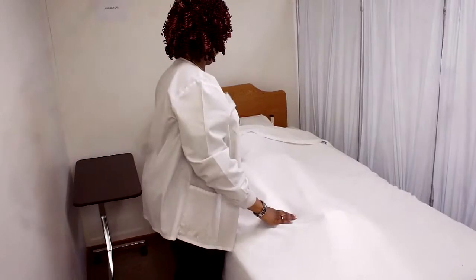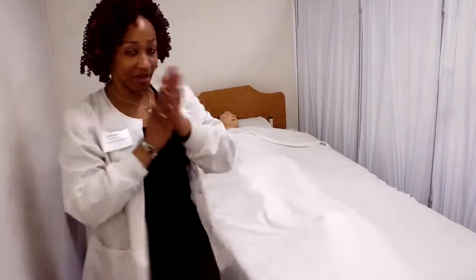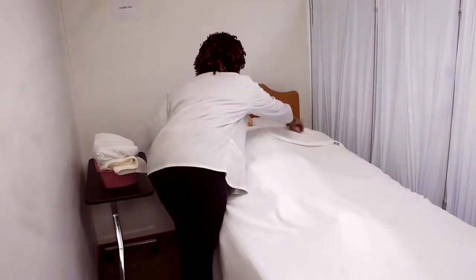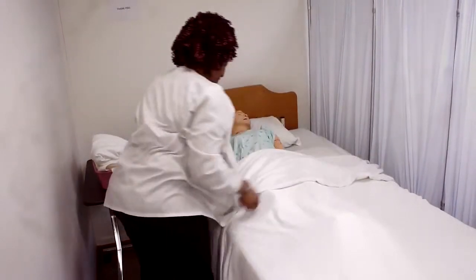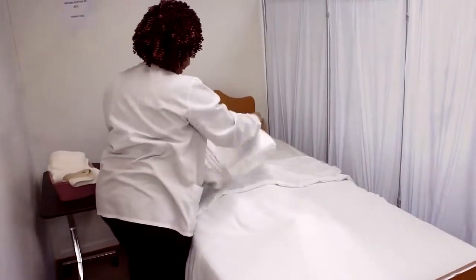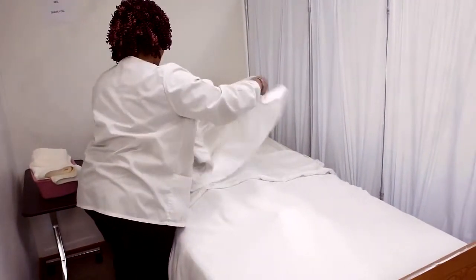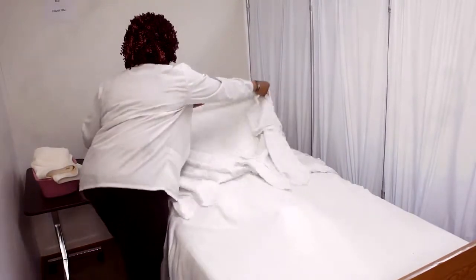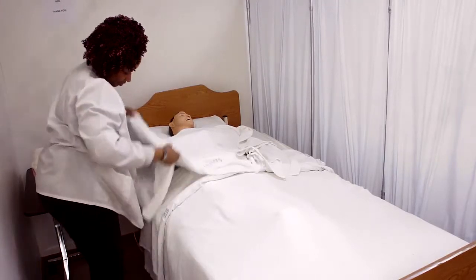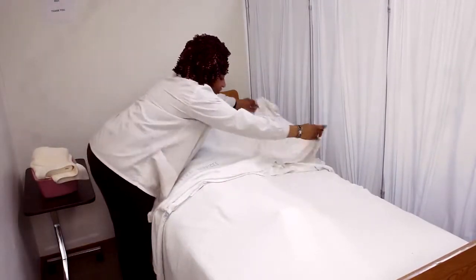Okay, Mrs. Johnson, I'm just going to go ahead and wash my hands and get my supplies so we can get started. So I wash my hands. Again, we simulate for state. Grab our supplies. Come on back and we do a pre-prep. The peri-care and the catheter care have the same pre-prep, which means the sheet goes to the waist and then the blanket goes over top. We don't shake it. We don't put any linen or any supplies up against our body to avoid cross-contamination. You just want to place it gently.